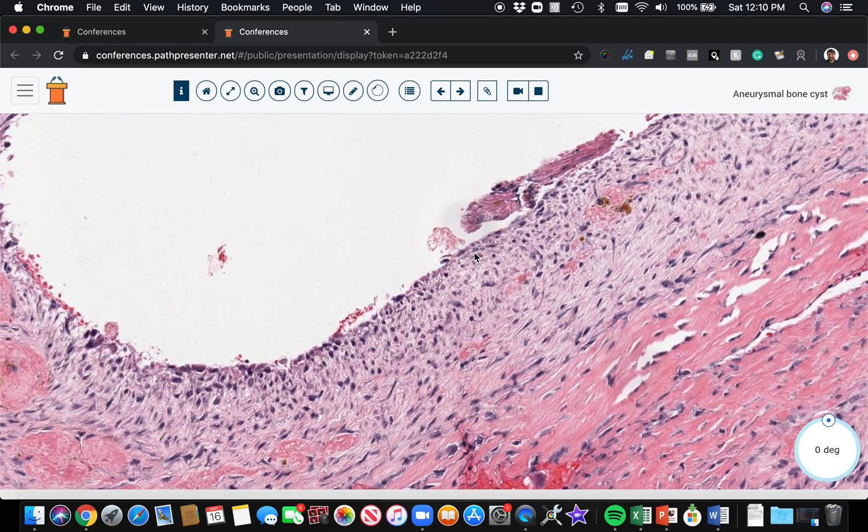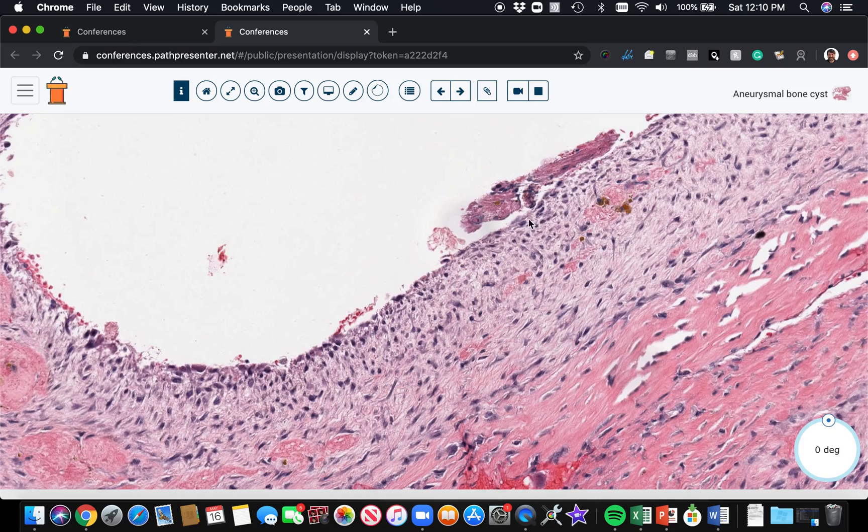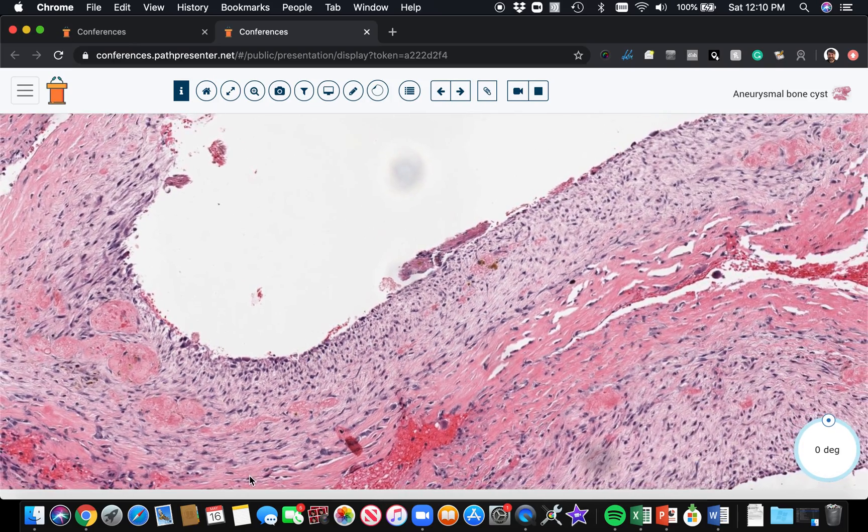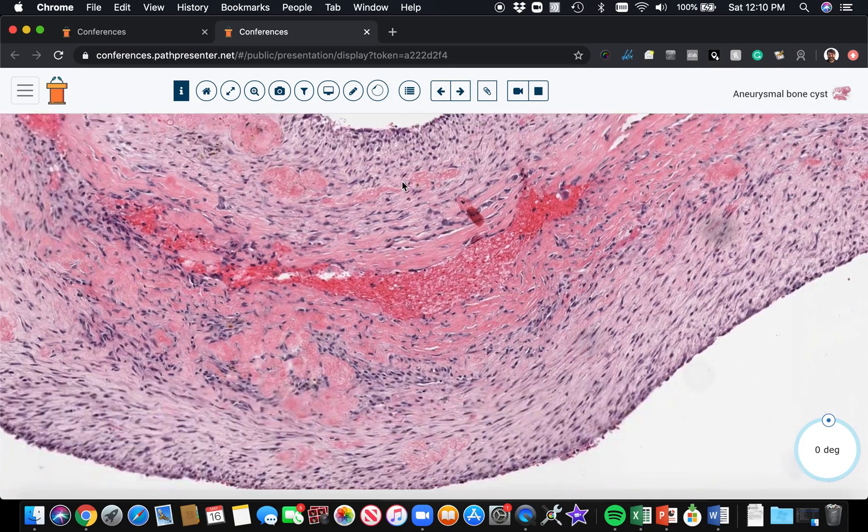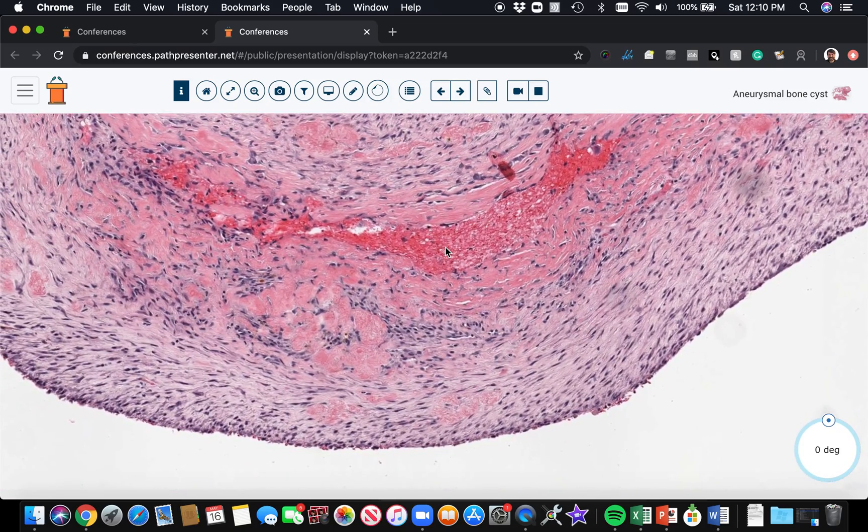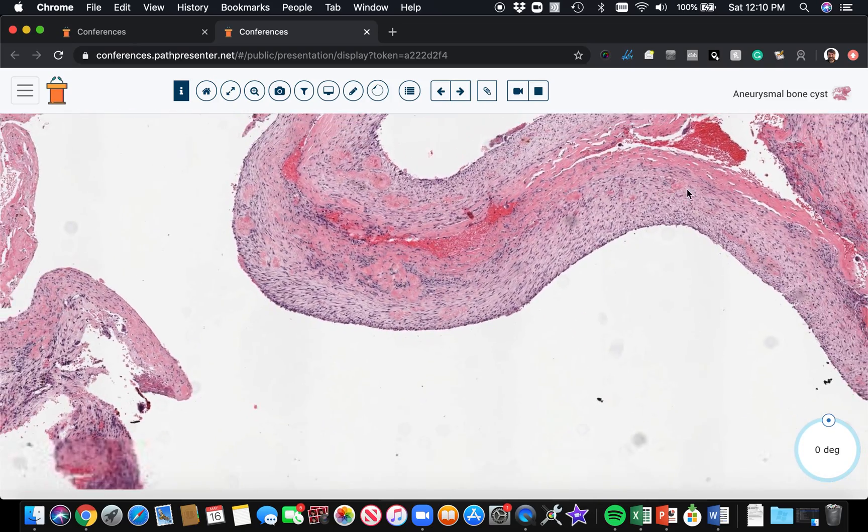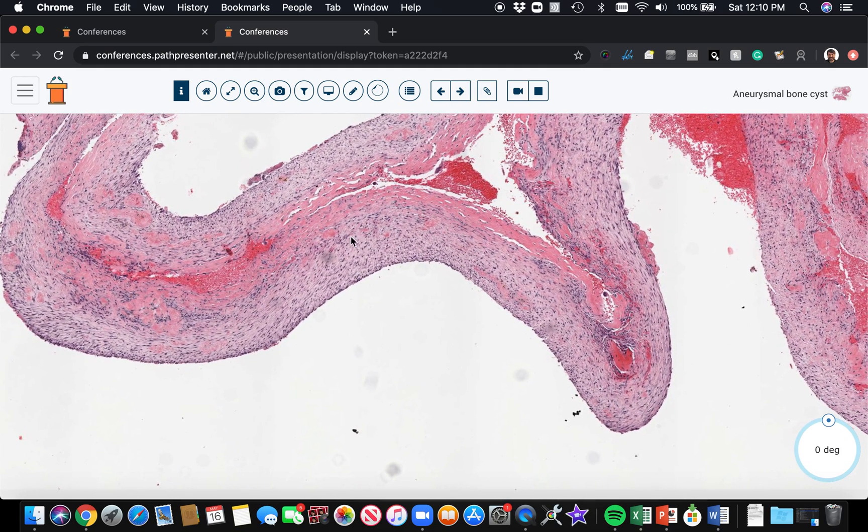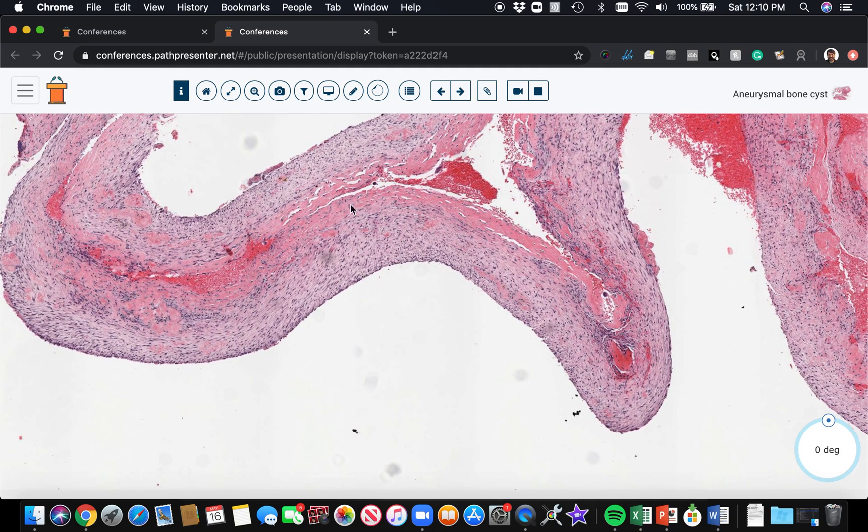Okay, the space is not really lined by any true lining, it's kind of a pseudo-cystic space. And what you'll often see in these walls is loose stuff like this, but also some very dense collagen that's sclerotic.